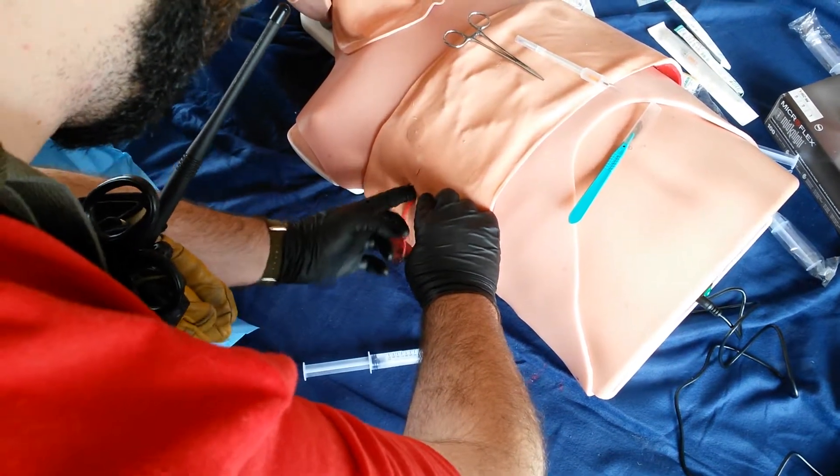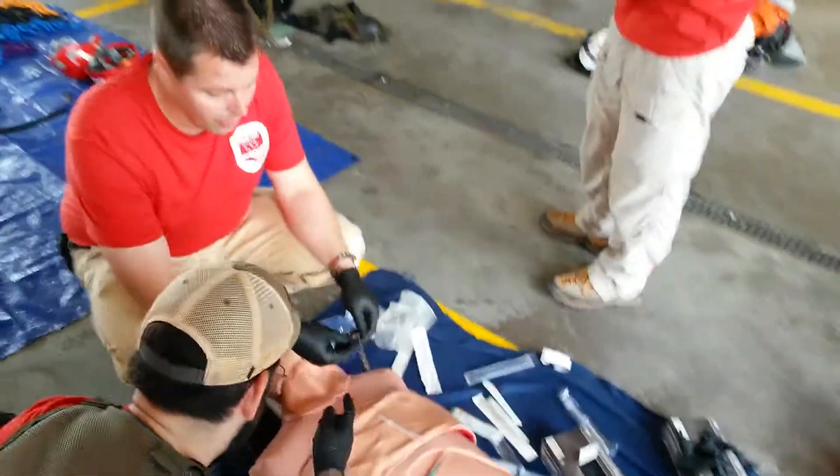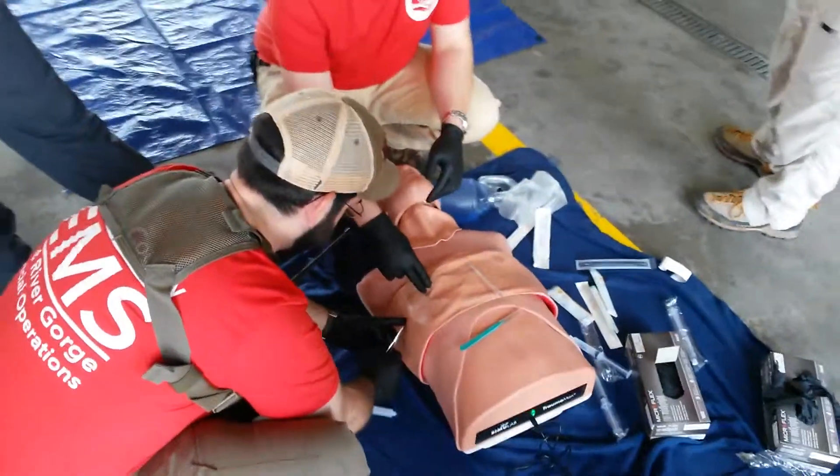It's just skin, essentially. You can always sew this back up with a little bit of suture afterwards if you didn't need it. To go in first, you're going to have to dissect through a little bit of tissue.